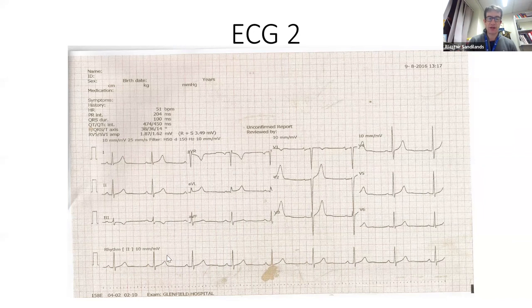Now we look at the spacing between all the R intervals. So we've probably got 1, 2, 3, 4, 5, 5¾. What's 300 divided by 5¾? 300 divided by 5.75 is 52.17. So they're all roughly around the same. They're not absolutely the same, but they're all around the same ballpark. So the computer's saying 51, the R interval's saying 52, and the other way is saying 56.